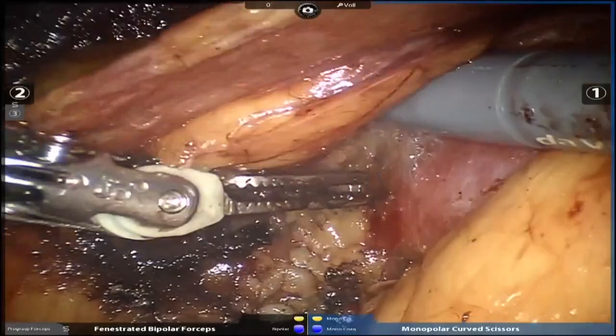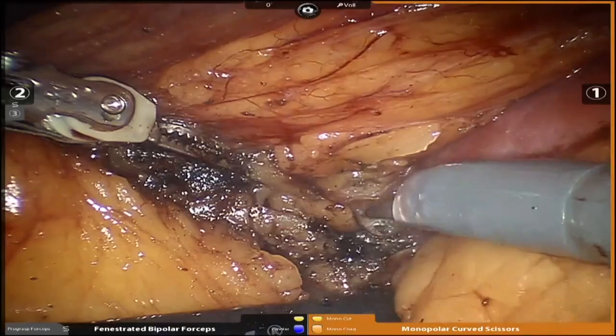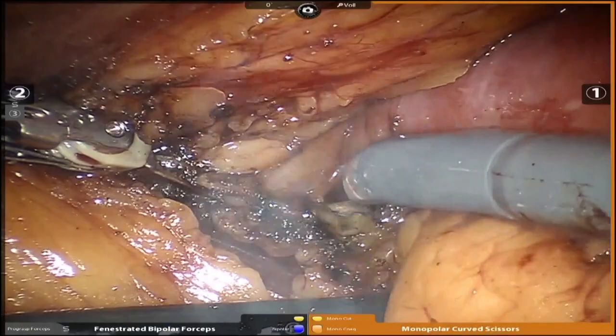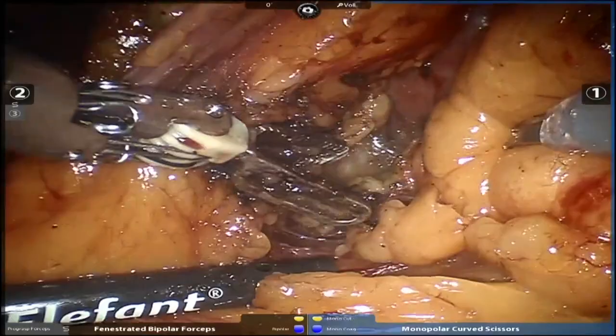In the U.S., we weren't trained to do ultrasound routinely, like a lot of the urologists in Europe are, so we're not used to seeing things in ultrasound on a regular basis. Then I think you become very good at it. You can see calyces, you can see sinus fat, you can see deep tumor projections. It does help with your ability to identify what's going on. It's practice. The more you do with the ultrasound, the better you become, and the less dependent you are on the radiologist. I think that's a good thing.